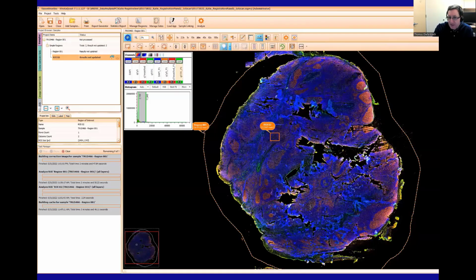So we did a test recently. Again, this is lymphoid tissue. This is showing the StrataQuest interface. And here we see the entire tissue section that we were interested in. And we imaged this twice, with two staining panels. So it was basically DAPI with just 3 fluorophores. We wanted to keep it simple at the beginning and just have a 3-marker panel for each scan. The ROI that I have outlined in the rectangle, somewhere near the middle of the tissue, is the region we'll be zooming in on.